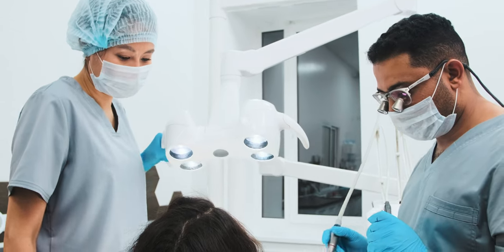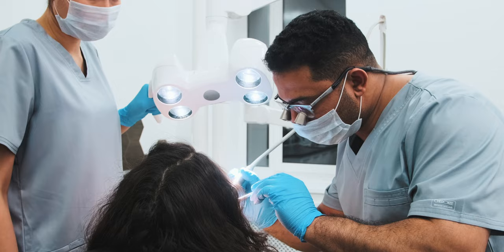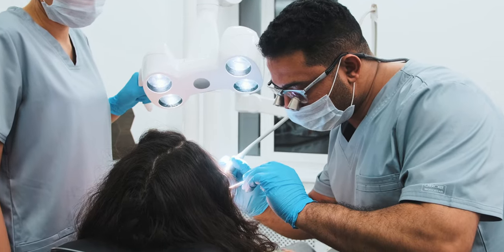First off, what are loops? These are surgical loops. We use them as dentists and dental students to get a way closer view of what we're working on. Anything that involves getting a better close-up image, these things really help us see, and when you're working on something as small as a tooth from a couple feet away, this extra magnification really helps us get in close and get the job done.